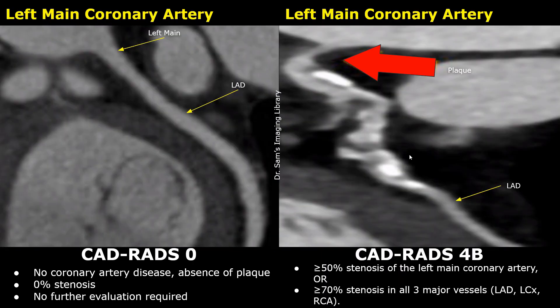In CADRADS-4B, there is a stenosis of 50% or more in the left main coronary artery, or if there is more than 70% stenosis in all three major coronary arteries — the left descending, left circumflex, and the right coronary artery. In this normal image, this is the left main coronary artery. There is no narrowing of the lumen and no presence of any plaque. The enhancement is normal.